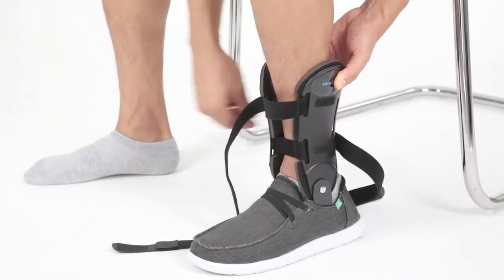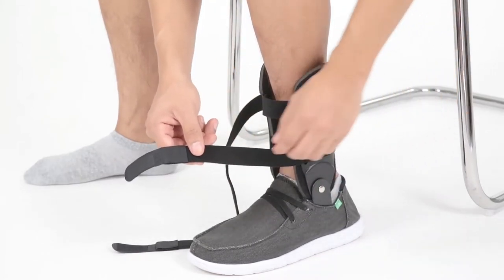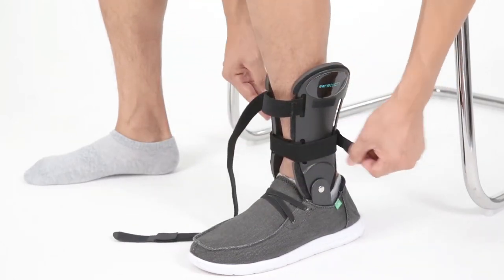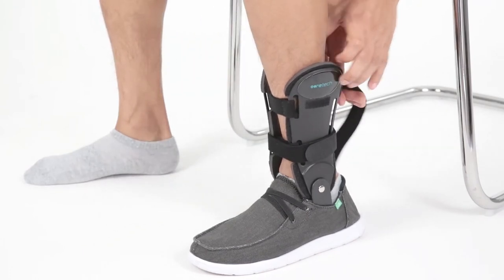Secure the bottom strap first, then the top by wrapping each around the back of your ankle and securing with the Velcro closure. Be sure to test for comfort and fit and adjust as necessary.